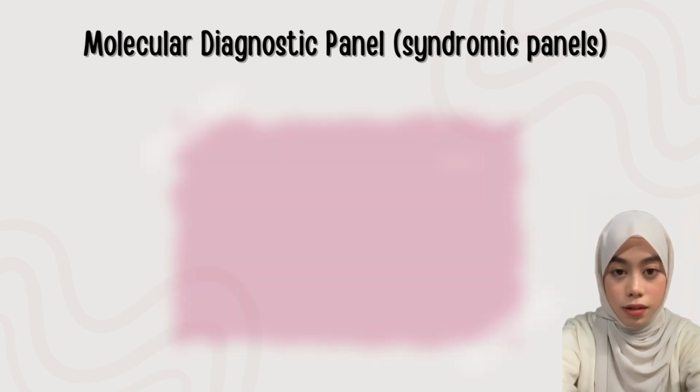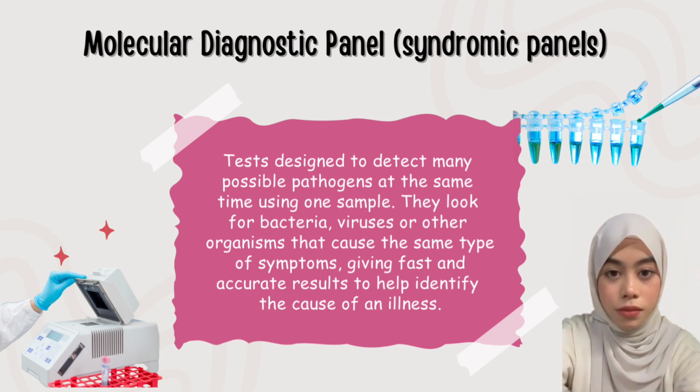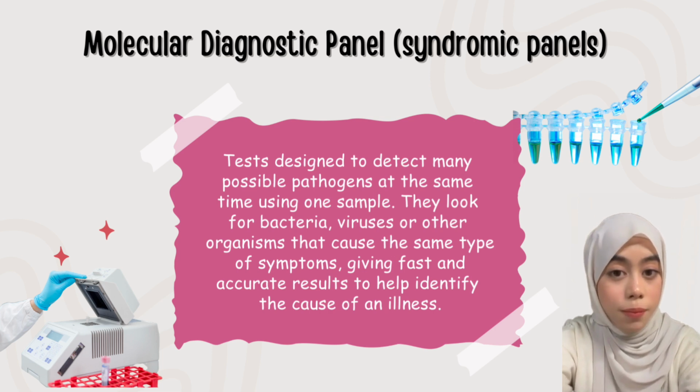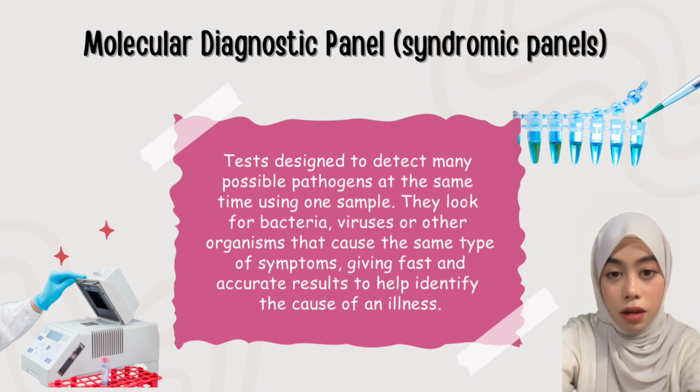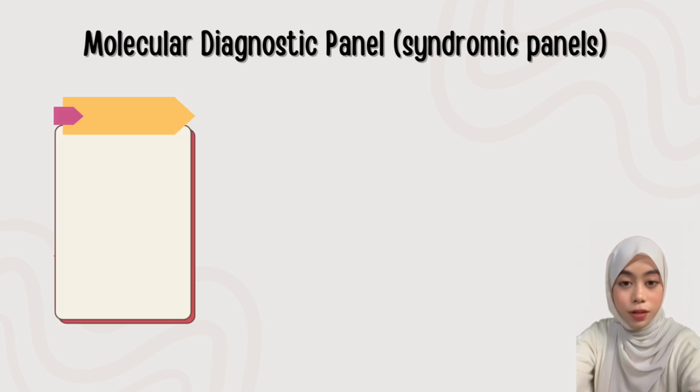Molecular diagnostic panels are tests designed to detect many possible pathogens at the same time using just one patient sample. Instead of running multiple individual tests, this single panel can detect bacteria, viruses, and other organisms that cause similar symptoms. A good example is respiratory panels.